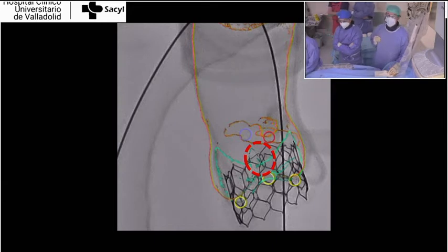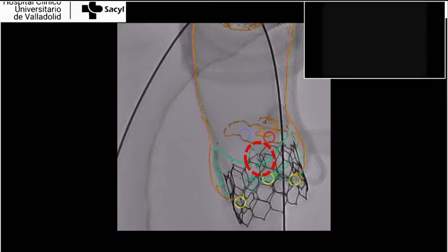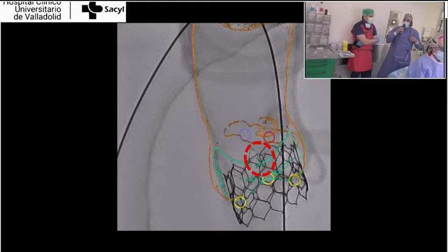And then in this case, we are doing something that is very fashionable now, but I think is not shown yet with balloon-expandable valves. We are going to do commissural alignment. So I want our colleague Alfredo Redondo, interventional cardiologist, to explain how we are going to do the commissural alignment with this balloon-expandable valve. Please, Alfredo.